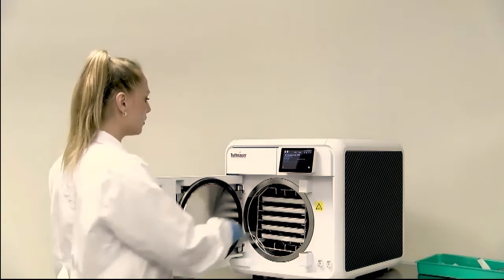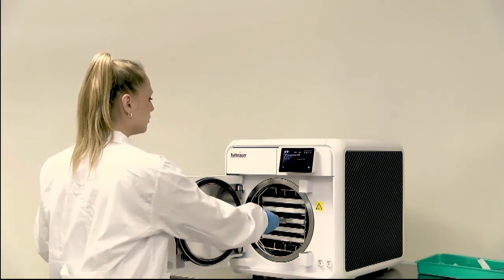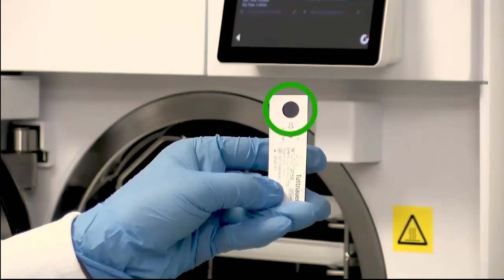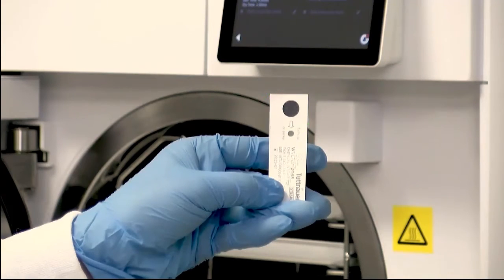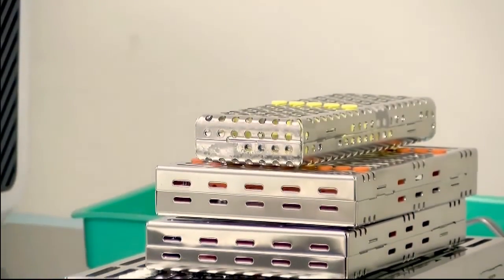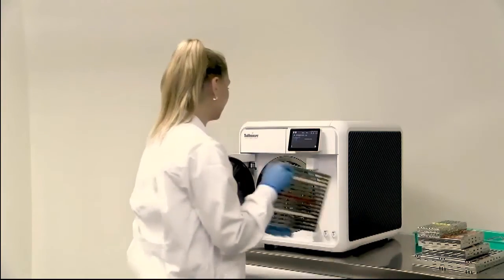When the cycle is completed, always check for the chemical indicator color change, assuring steam exposure. Rotate the equipment rack 90 degrees for surgical cassette loading.